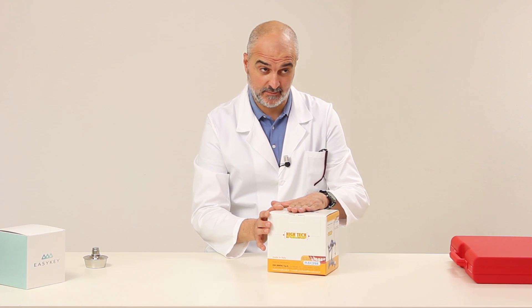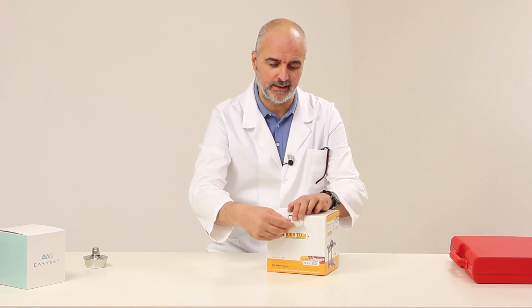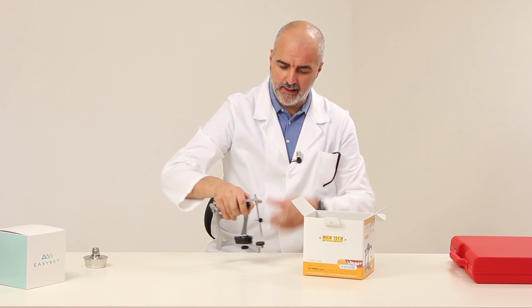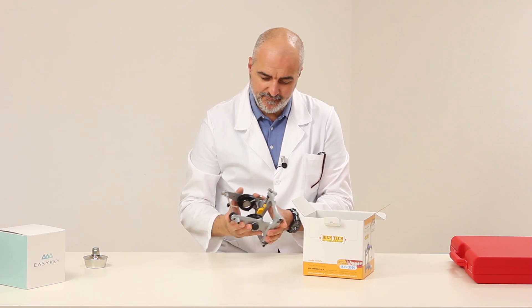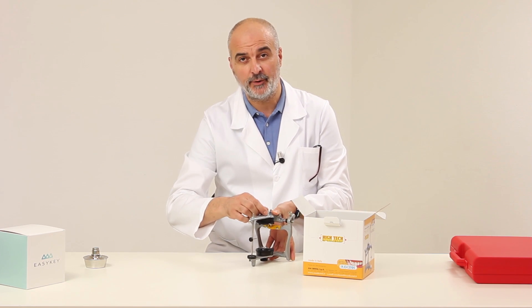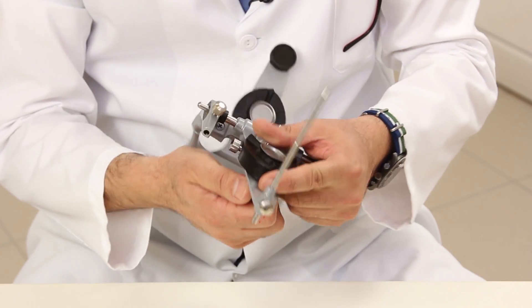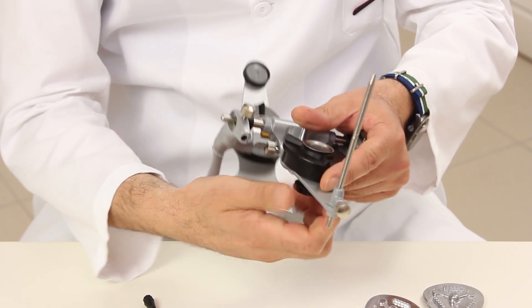First, let's open the box containing the Azadental Articulator Model 5032, a top-of-the-range Azadental product. Inside, we will find the articulator that differentiates itself from others for a series of specific characteristics that we will illustrate later. This articulator features a magnetic anchoring system for models.